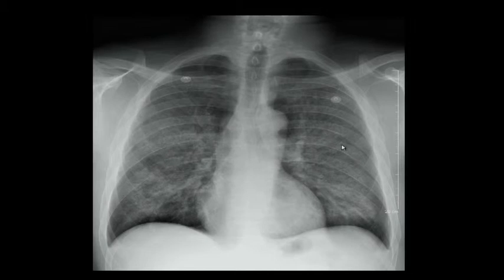Is there any question? These are too thick to be reticular. We will see reticular coming up in the next few cases. Somebody showed me this and asked, could this be pulmonary edema? I said, yeah, this could be non-cardiogenic pulmonary edema. Did the patient have any neurotrauma or things like that? Because it's very bat wing, very ground glass, very alveolar. You say non-cardiogenic just because the heart's not enlarged? Yes, there are no signs of right heart failure.